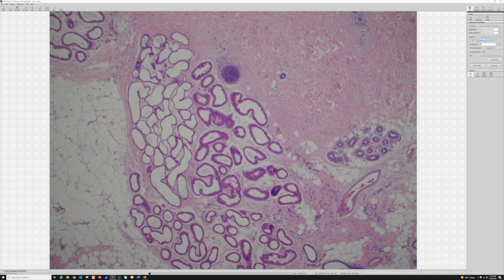If you see apocrine glands in sites other than that, like say I see apocrine glands on the scalp, I'm going to think about certain diseases like nevus sebaceous, which is a hamartomatous proliferation that grows on the scalp that tends to produce apocrine glands in the scalp where they're not normally supposed to be. And I've got a video about nevus sebaceous you can check out if you want.